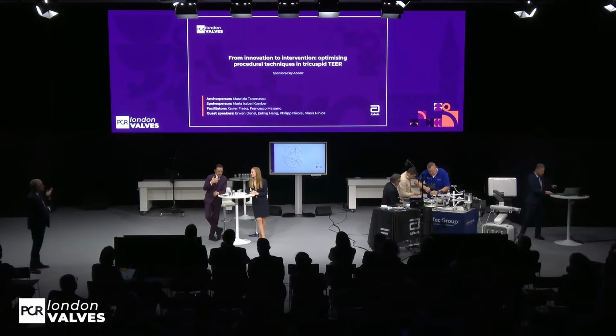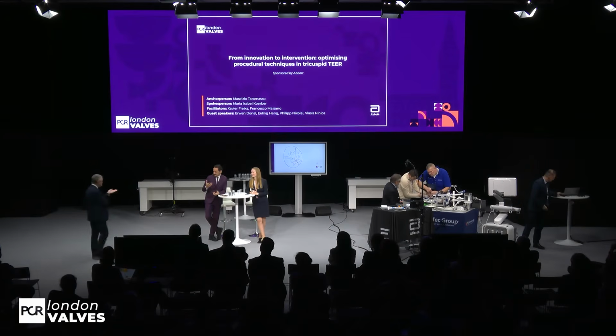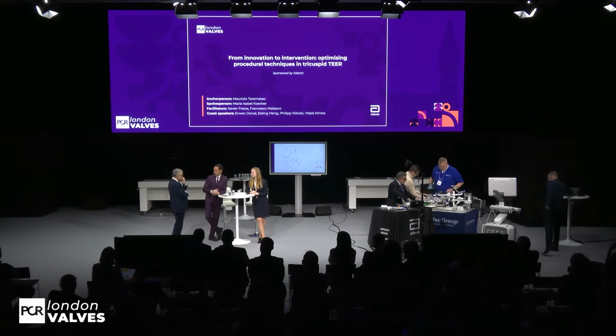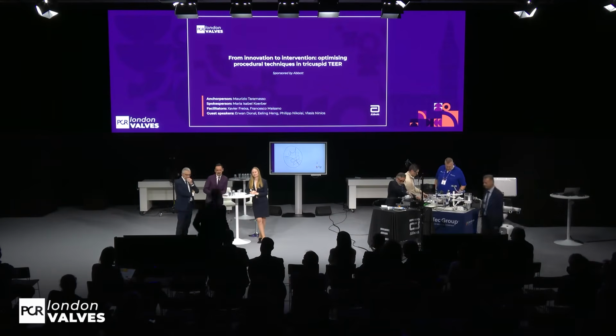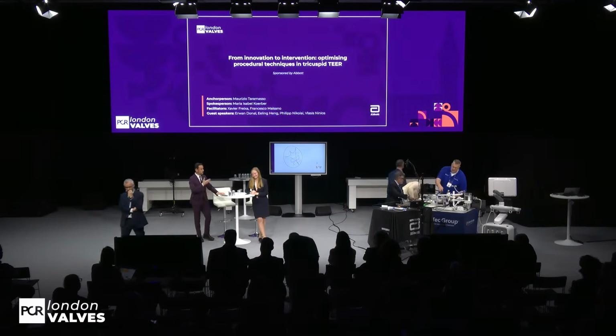Before moving to the next part, what is the conclusion of this session? Is Clover better or not? You said we don't know, but actually it's not completely true, because Xavier just presented some cases this morning, some data. Surprise. So obviously we need more evidence, but we have some information now on what should be the better, or at least the most durable, strategy.